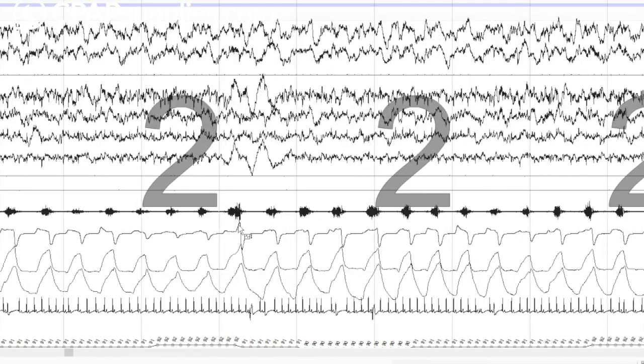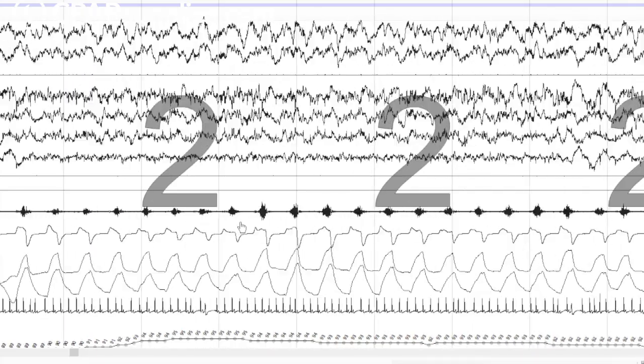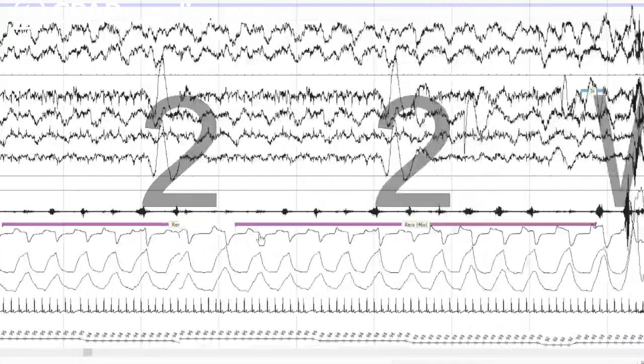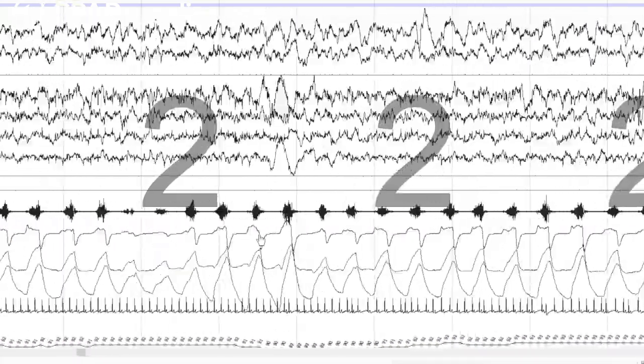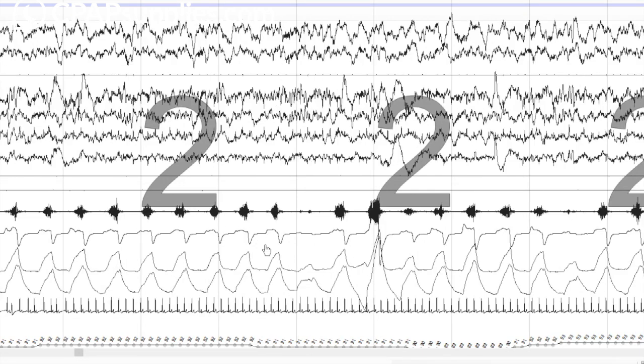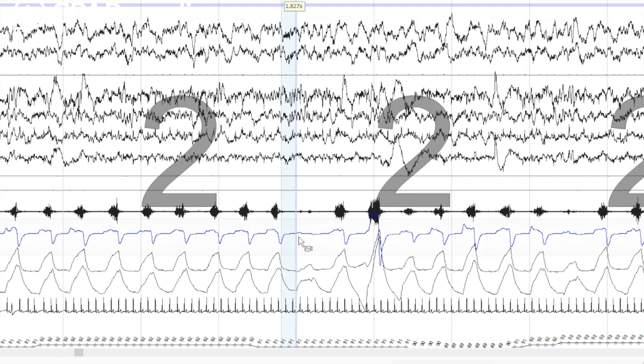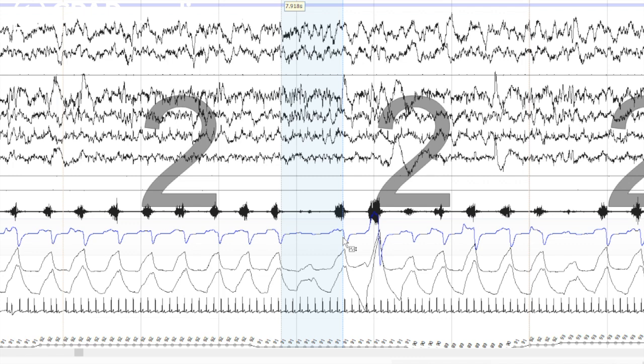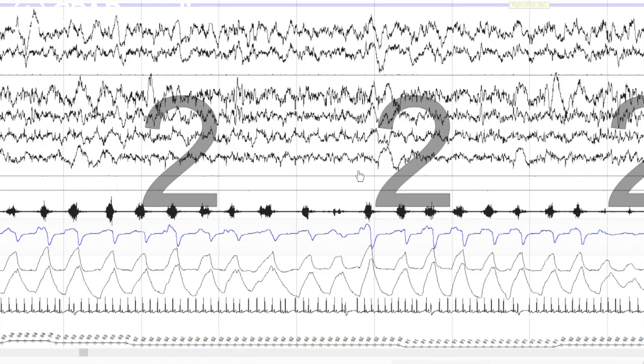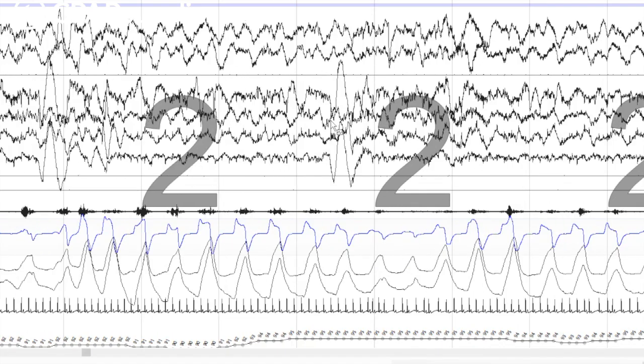So I'm going to move a lot faster because I just really want to show you a few things. Let's go back to this one. Oh my God, Jason, you missed it. They're not breathing. That's an obstructive apnea. No loser, it's not. Because it is only like 7.9 seconds. That's not enough to be an obstructive apnea. There's also no awakening. We do have a blood oxygen desaturation of 3% or more, but it's not long enough and it doesn't wake them up. So guess what? It doesn't matter.